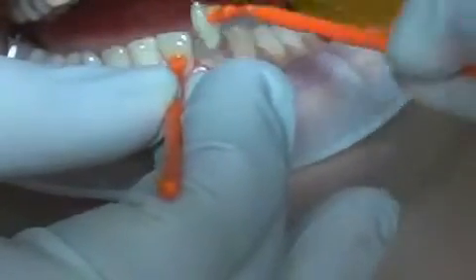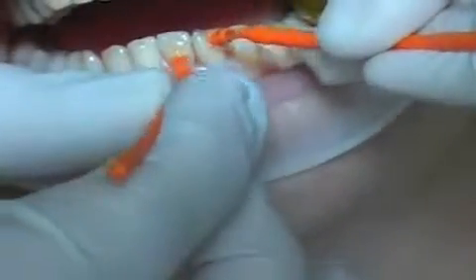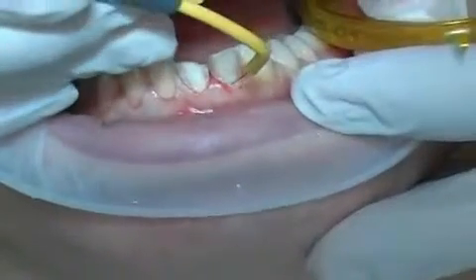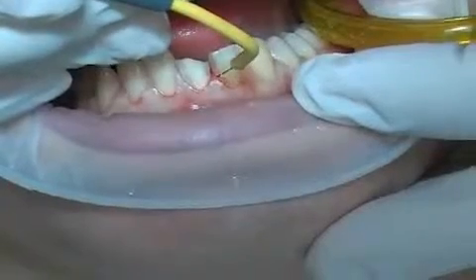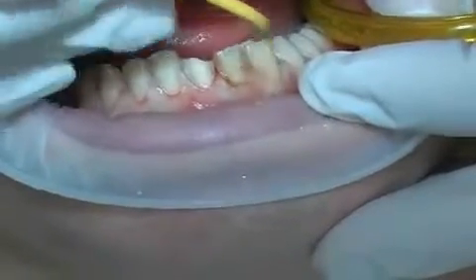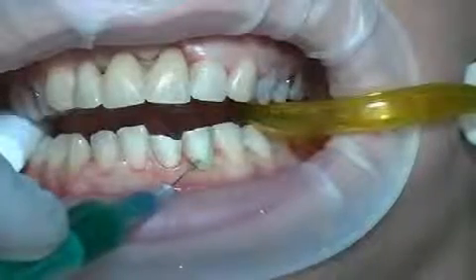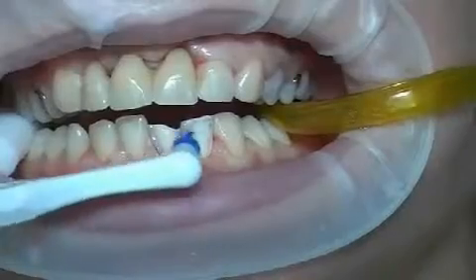Here you find the biggest differences in quality. Not all glues available on the market are suitable for veneer attachment. First, any existing bleeding is carefully stopped with the cauter. Clean work is extremely important during the gluing process, and there can be no saliva or blood present. The enamel is etched, the green paste, and the surface is treated with various glue products.